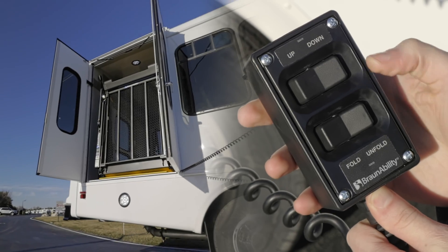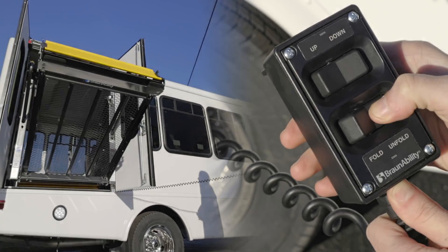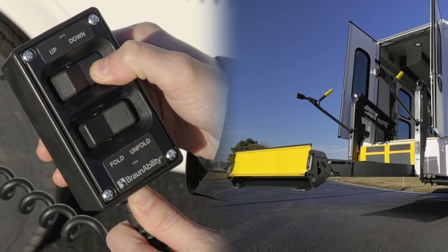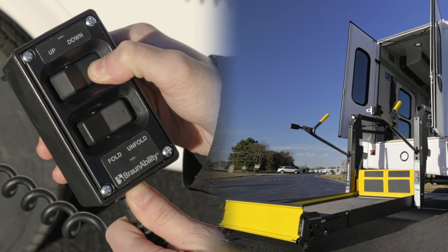First, you will want to hold down the unfold button to bring the lift down from its upright position. Once unfolded, hold the down button to then lower the lift to the ground, allowing easy access to roll onto the lift.